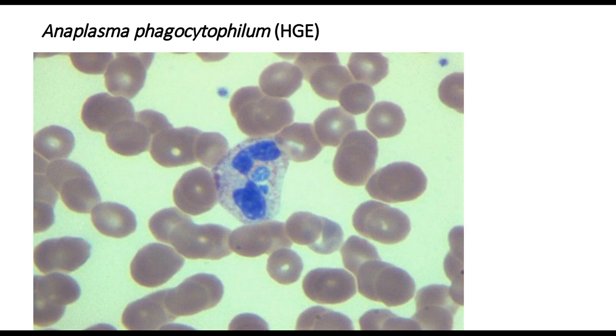It's a beautiful picture, isn't it, of an Anaplasma intragranulocytic inclusion, which somebody that's experienced at looking at smears will be able to pick up. There's not a lot of them, and it's not easy to see unless you stumble upon it. But when you see it, it's diagnostic.